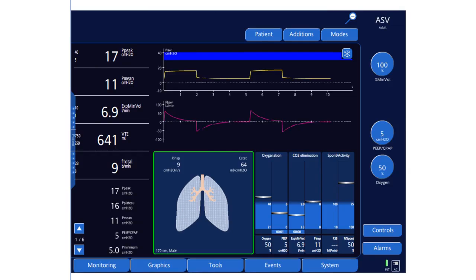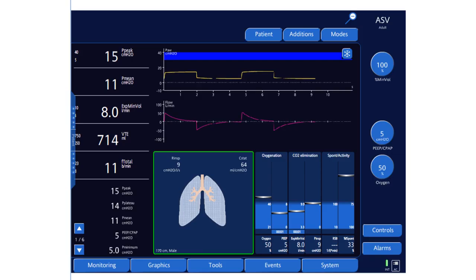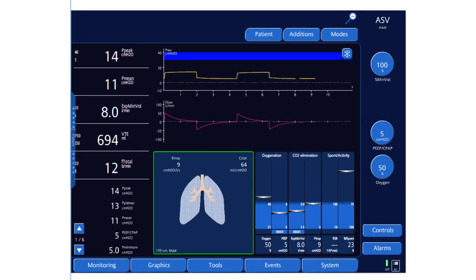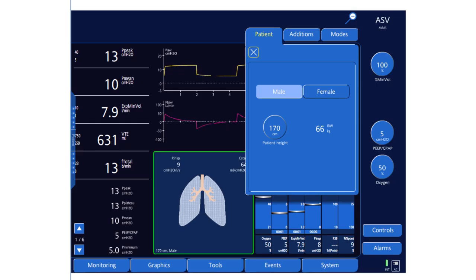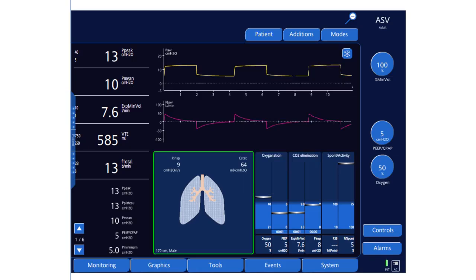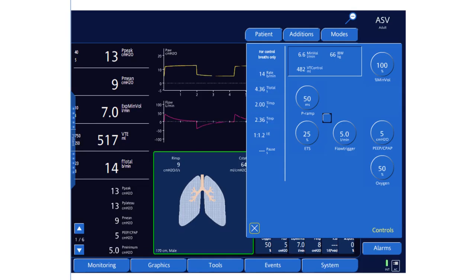Hi everyone. Today we will use the Hamilton simulator to simulate Adaptive Support Ventilation mode. If you have one of those ventilators that has ASV available, you can set it by going to the patient first. You need to put in the ideal body weight, which is calculated automatically from the patient's height and gender. Then you go to Modes and select ASV, confirm it's already selected, and go to Controls.